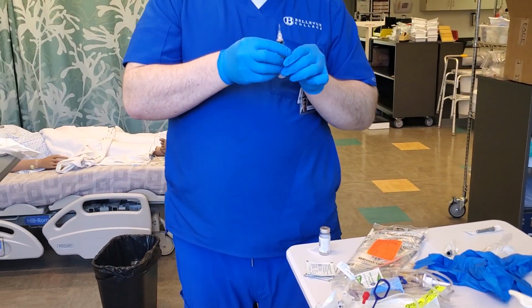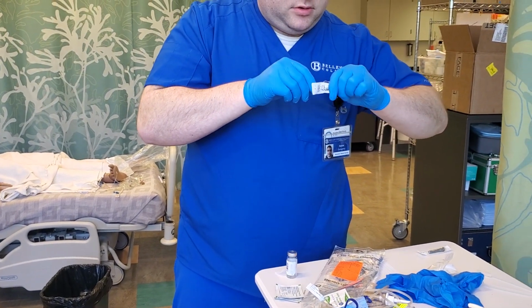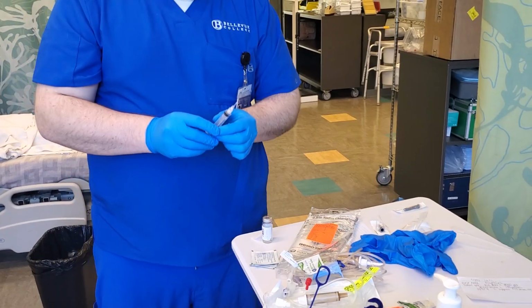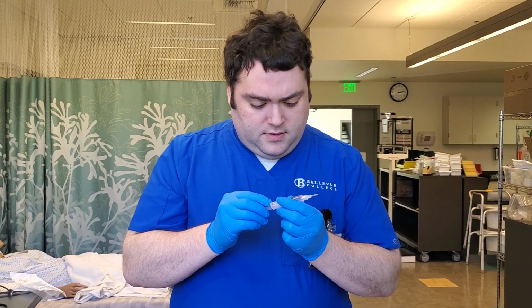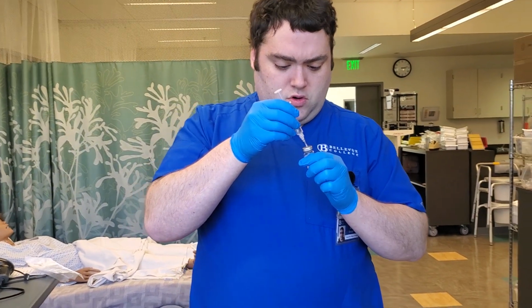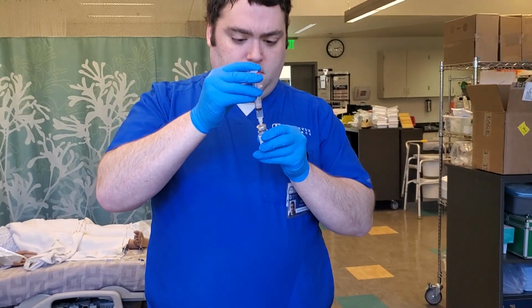We'll go ahead and draw out 2 of air. Let's draw a little more.